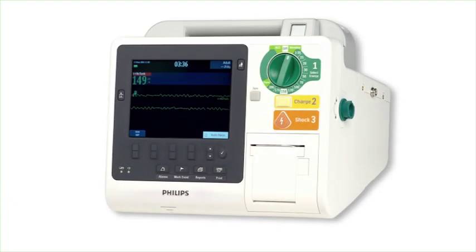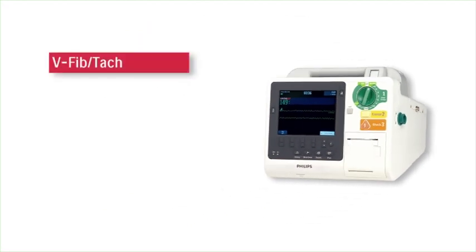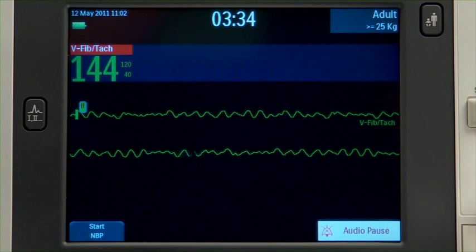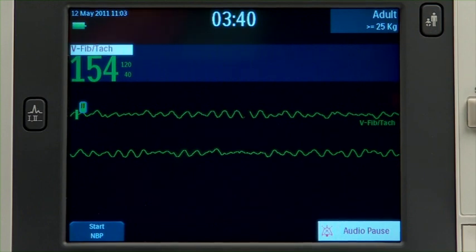The HeartStart XL Plus generates different alarms indicating changes in patient condition — physiological alarms — or device and cable conditions — technical alarms — that may require attention. There are three alert levels: high priority, medium priority, and low priority. A high priority alarm warns of a life-threatening condition, such as asystole or ventricular fibrillation. The alarm message displays with a red background.